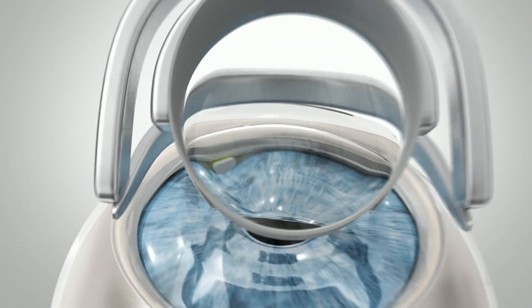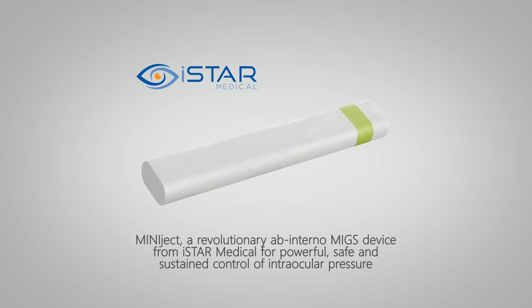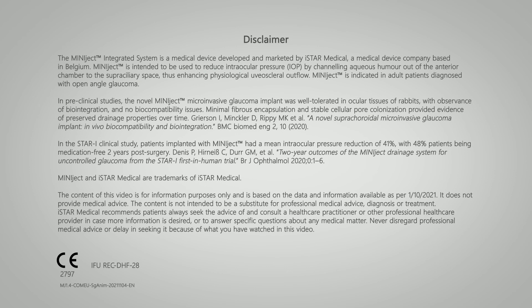Miniject, a revolutionary ab interno MIGS device from iSTAR Medical for powerful, safe and sustained control of intraocular pressure.